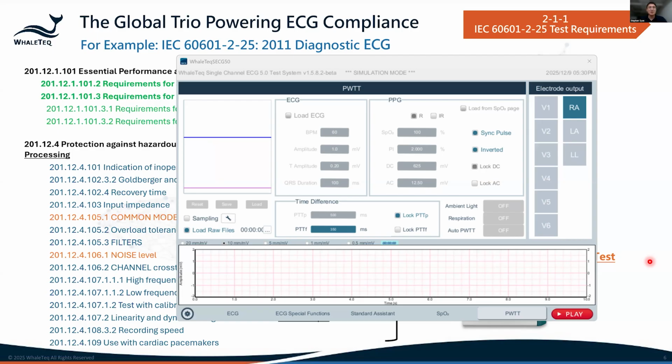Target groups. I think that means who might want to use it. So we have a very strong user base. They are the certified test labs. Those certified test labs verify all the ECG applicants; the manufacturers submit their device for verification, and then those labs run the test on their ECG prototype and give them the stamp of certification.